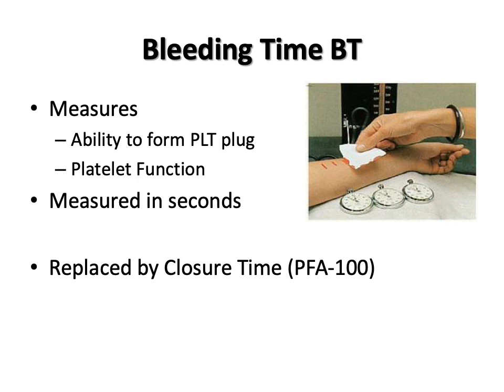The test is finished when bleeding has stopped. The time from when the incision was made until all bleeding has stopped is measured and is reported as the bleeding time.